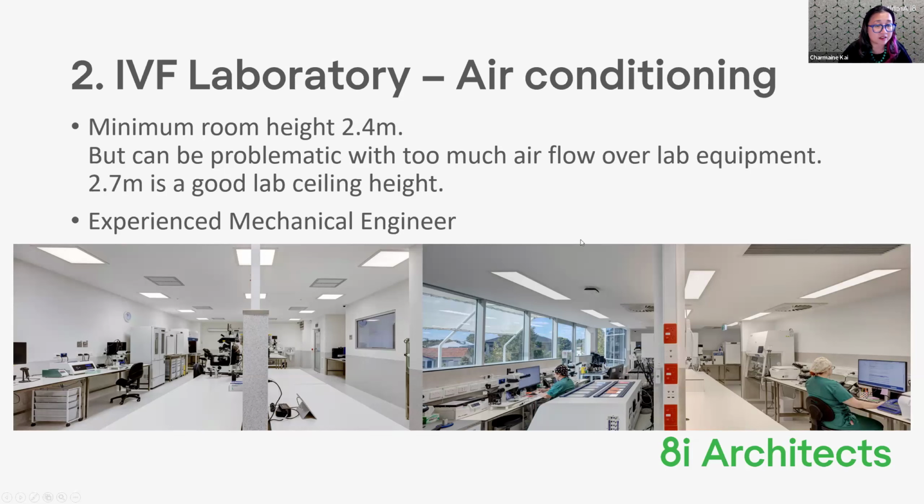So reiterating the fact that it's so important to get an experienced mechanical engineer when you're designing a lab, particularly for IVF, because then they will understand your requirements, and they'll actually do a really good job.